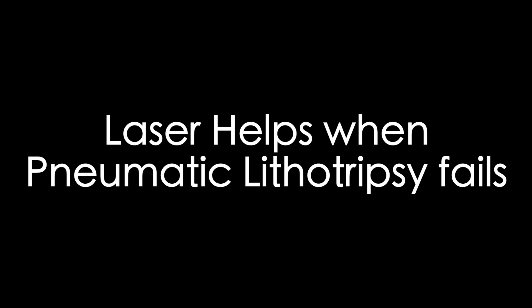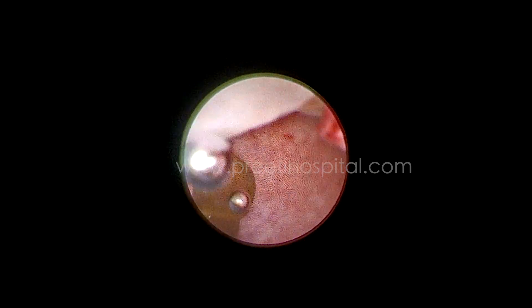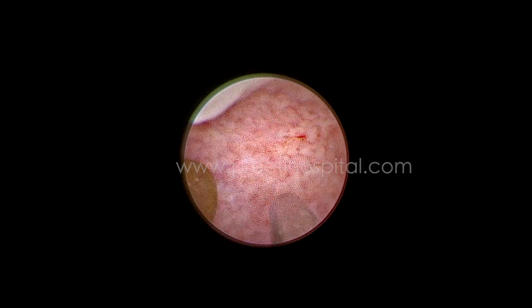Here is a case of a round smooth stone floating in the pelvis. When the pneumatic lithotriptor is applied, it is continuously moving and we were not able to break it — it is going here and there and we are adjusting the amplatz sheath, but it is not breaking.